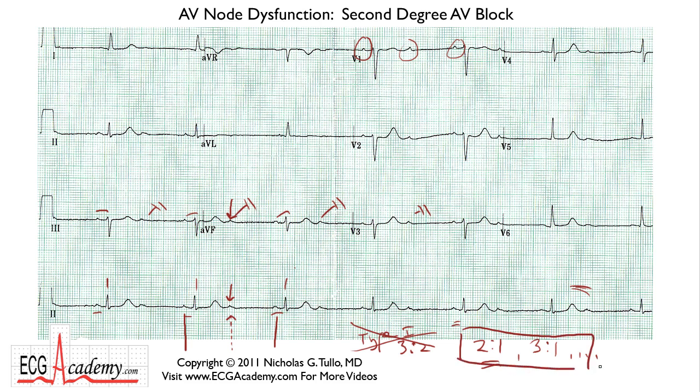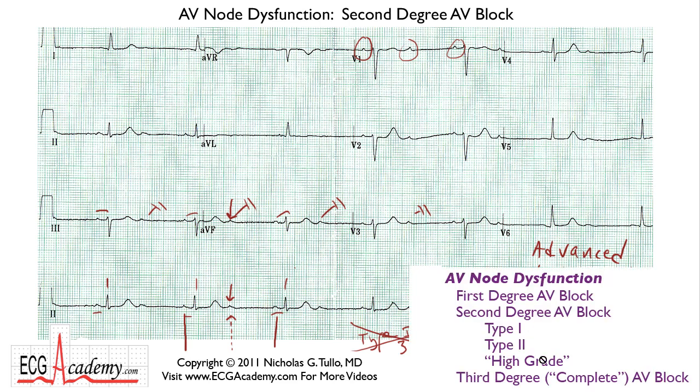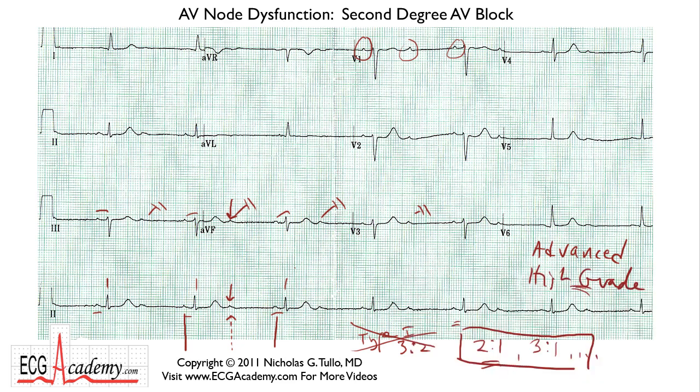That is high grade. Some people call it advanced AV block, or high grade is really my favorite expression. So high grade AV block is in its own category. And that's the way I wrote it, high grade. Okay? You can get very high grade periods of AV block.